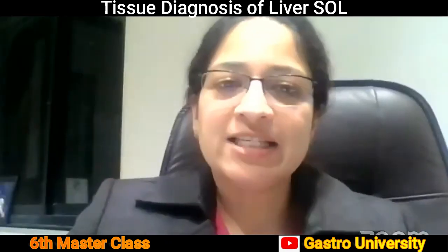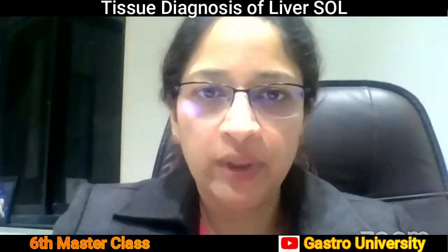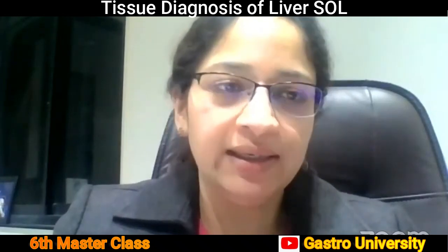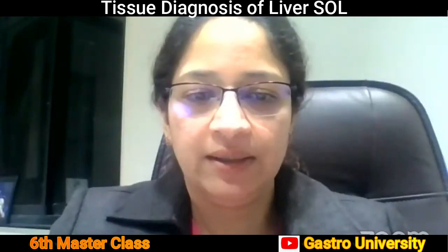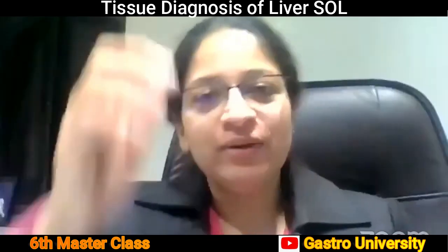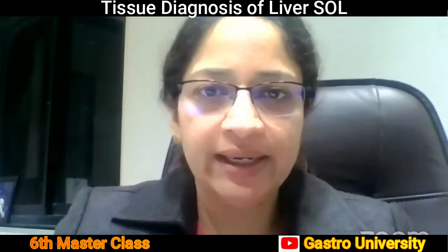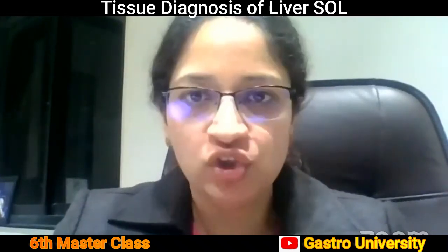So fine needle aspiration cytology is usually done with a 23 gauge needle. It's usually preferable to do it with a 23 or a 24 gauge needle. It yields a good amount of material with minimal hemorrhage.